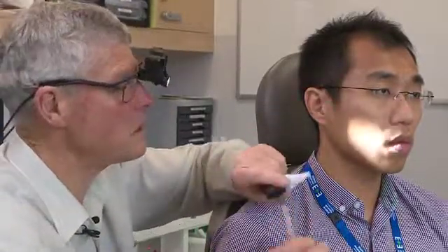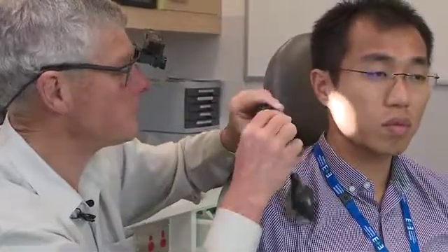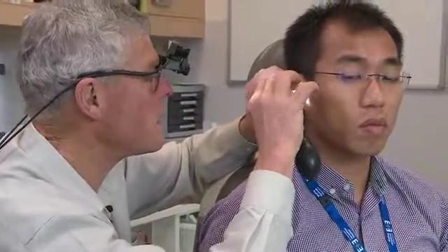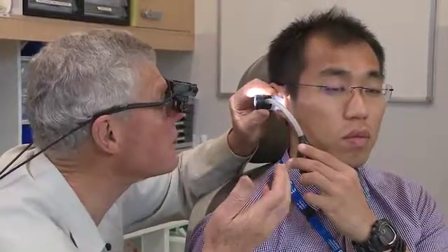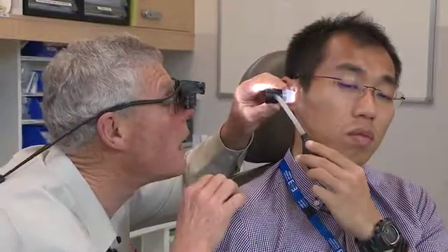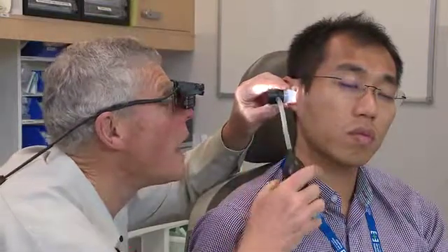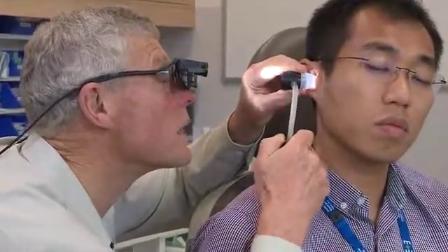So how does it work? You just show it to your patient and say it's air, it feels like that. You might demonstrate it in your own ear, but you're cheating by putting your finger over the end so you don't make it dirty. And then it feels like that. The other tip is it's best if you have it hanging down here so your patient can reach it, and then say: can you help me by puffing it? Just the surprise of how air feels up against your eardrum makes it worthwhile doing that. Now I'll see better — firstly I'll get a better seal by wiggling this in a little bit more. And I'll make sure that this doesn't move so I can get a much better impression of movement.